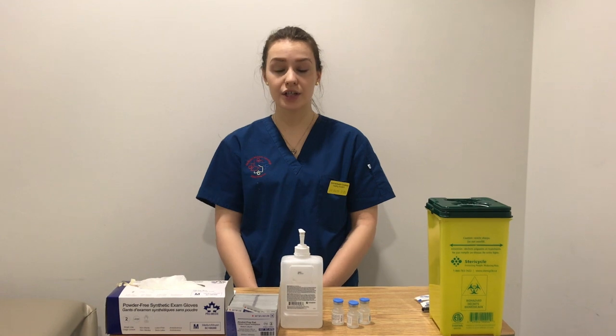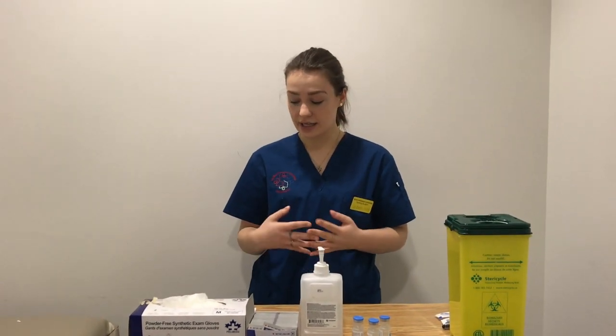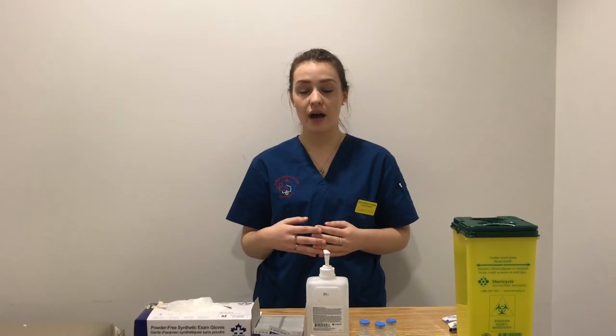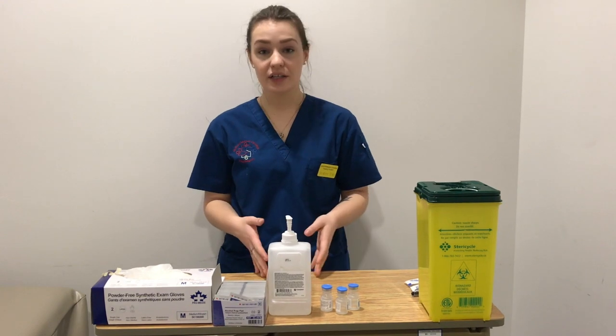Today I'm going to be preparing a subcutaneous as well as an intramuscular injection. So before entering the patient's room with the medications prepared already, it's really important to read over the orders that are in the MAR from the doctor. When looking over the orders in the MAR, you're going to ensure your 8 rights of medication administration. So you're going to make sure you have the right patient, the right medication, the right dose, the right frequency, the right time, the right route, and then the right site. These are all really important so that you know that this is the medication that Mr. Mancini should be getting.